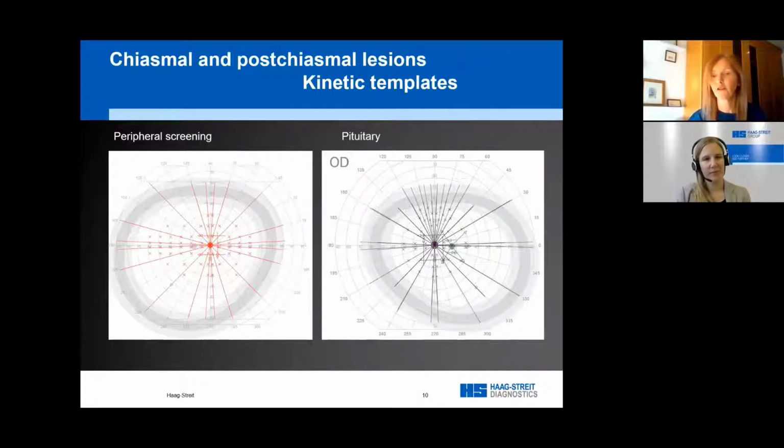They're largely based on knowing what types of visual field loss we're looking for, or the need for a practical screening assessment. We first started to use standardized templates back in the 1990s, before the Octopus perimeter was available for kinetic perimetry. At the time, we used the templates for Goldmann perimetry because we needed standardization to do the same testing procedure, making sure that that was repeated properly over several visits, or if it was being done by different examiners. Once we started using the Octopus, we customized those previous templates and stored them on the perimeter through iSuite.